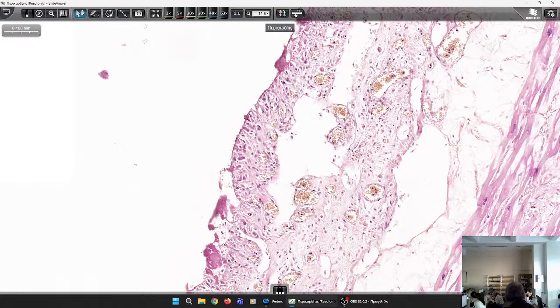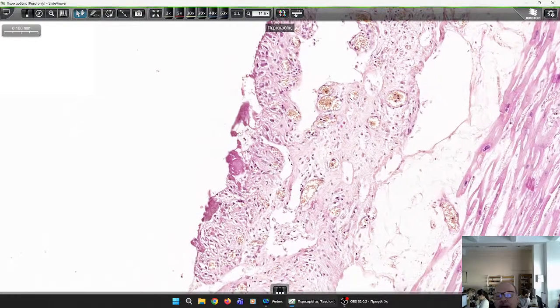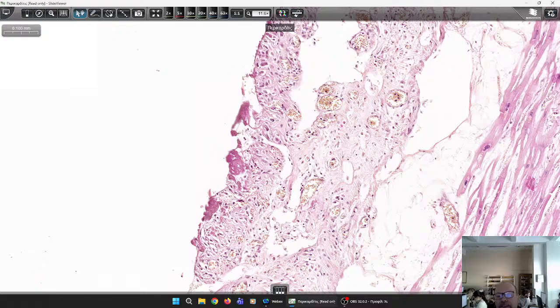And this is how inflammation starts, due to the chemical mediators, histamine and other vasoactive amines. More blood is sent to the area where the damage took place, and so we have congestion in the capillary circulation, evidenced here. And look at this. Here they are. This is the fibrinous exudate.